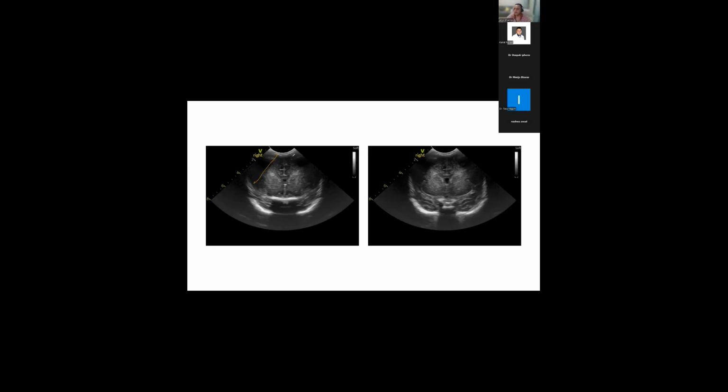I've got dropout in this region. So actually, it's quite dark over here, but it exaggerates my frontal blush a little bit. But really, for a frontal image, I am getting a lot of the frontal hemisphere. I'm getting the orbits, some of the frontal bone, cavum septum pellucidum, and the corpus callosum.